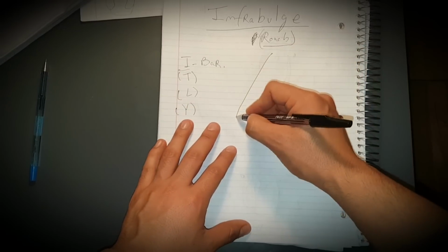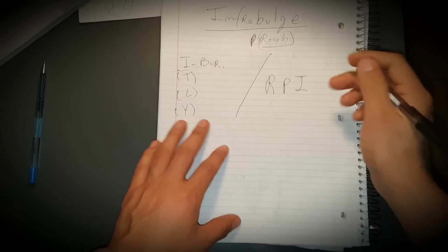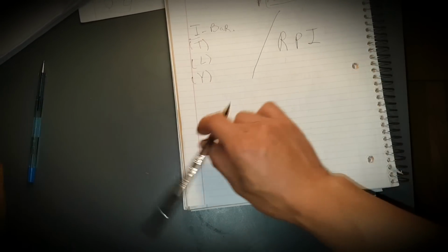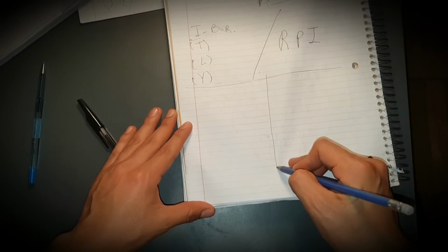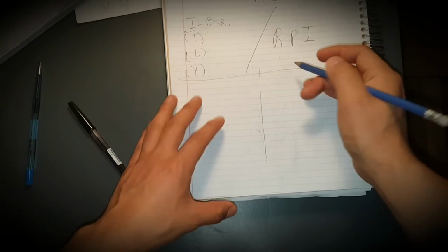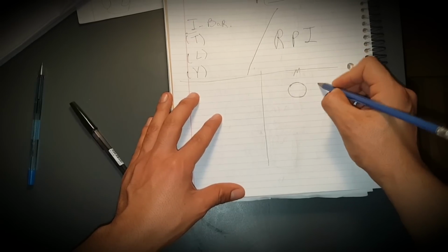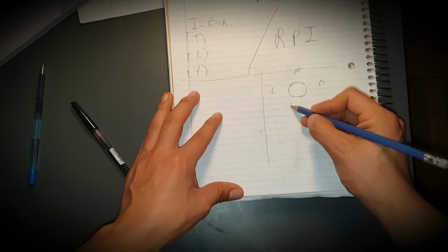And what's the difference between an RPI and an RPA? I see that there is a lot of confusion when we talk about these two designs. So I'm going to draw here what it means to have an RPI as opposed to an RPA. I'm going to draw a premolar. This is mesial, this is buccal, this is lingual, this is distal, and we have a free end saddle.